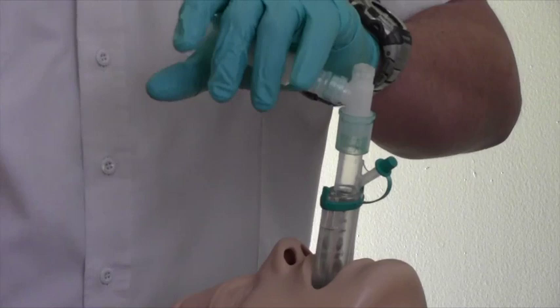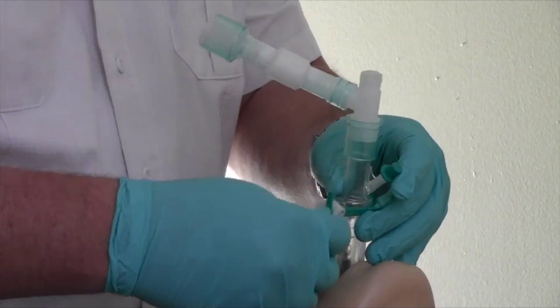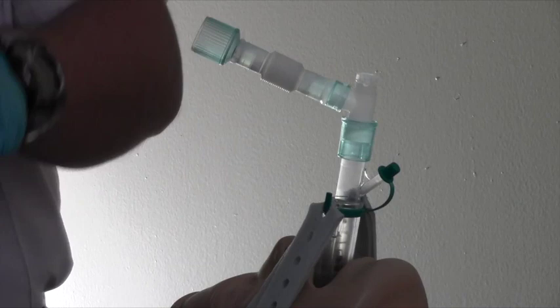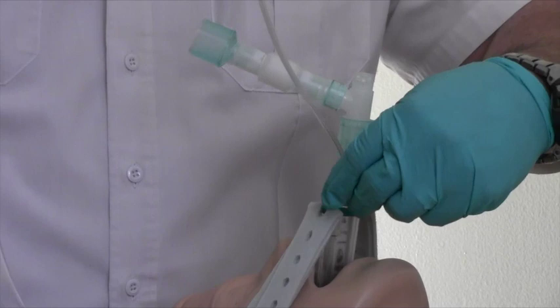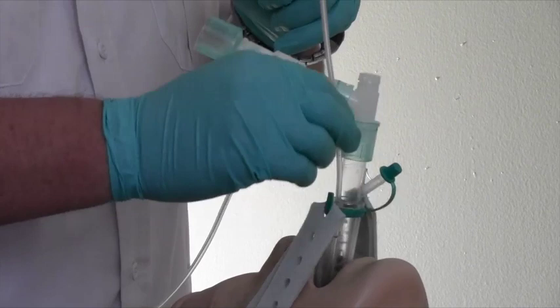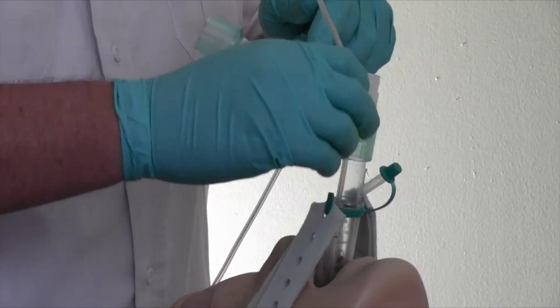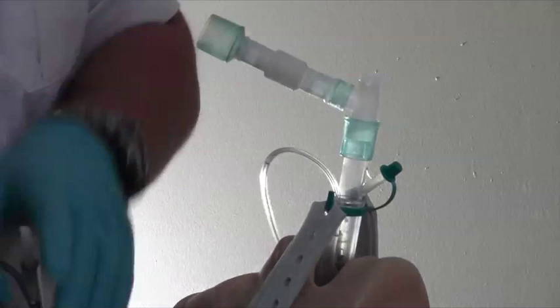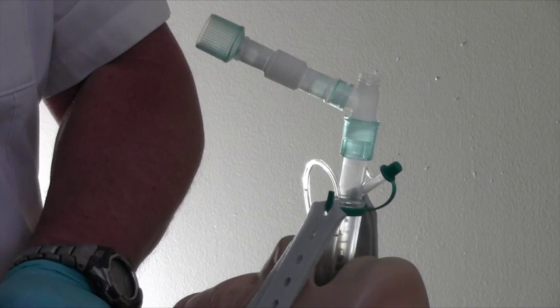The IGEL resus pack contains a strap that is used to secure the IGEL in place. You can also place an NG tube through the dedicated port on the side of the IGEL. There is also a supplemental oxygen port that can be used if needed.